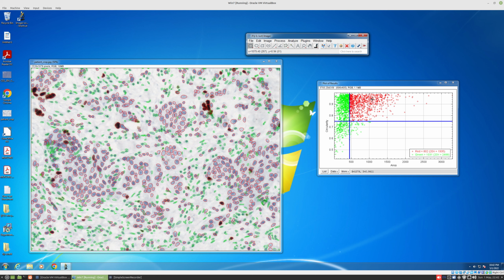And this may help you to assess CPS, because knowing the number of tumoral cells, let's say here, the expected number of tumoral cells at 20x is close to 2000. So you would expect 20 events of positivity for PDL1, either membrane staining for the tumoral cells or immune cells, either lymphocytes or macrophages, but not the stromal cells.